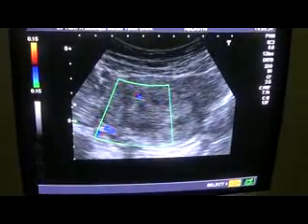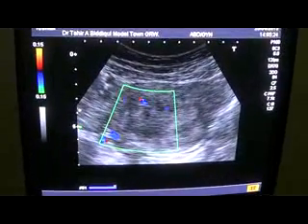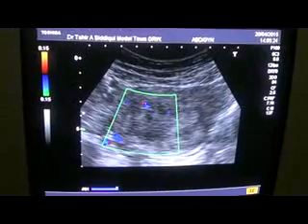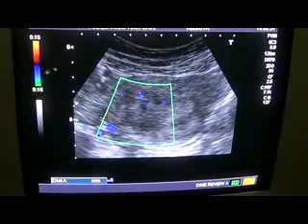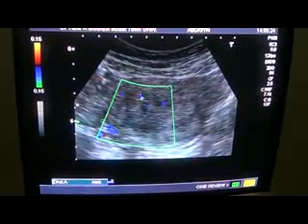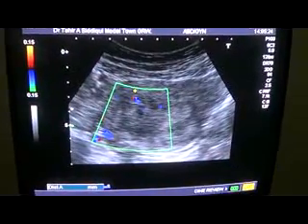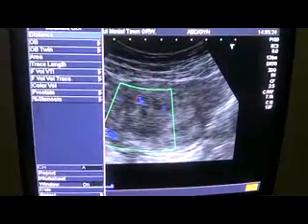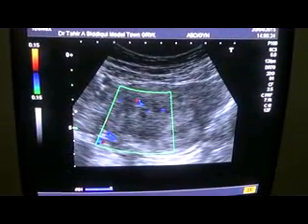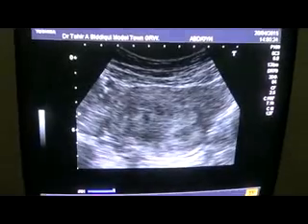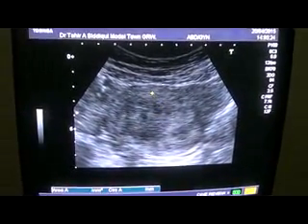Here we see the same mass once again, with internal vessels — both arterial. If you see this colour bar, there is arterial and venous flow type of blood within this mass, which is consistent with a fibroid.